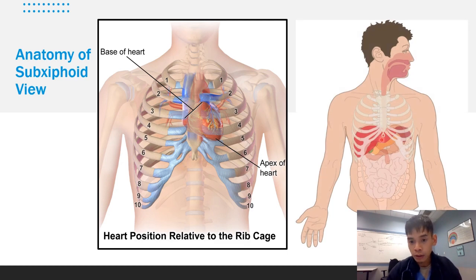And that would be this image over here. So as you put the probe placement around here, you most likely will pick up some liver, maybe some stomach as well, as that's all in that region. And even outside of that, you might see some abdomen, some rectus abdominis if they have a really strong 6-pack or subcutaneous fat, et cetera, okay?